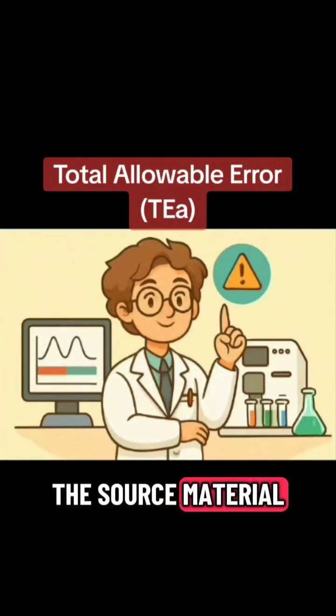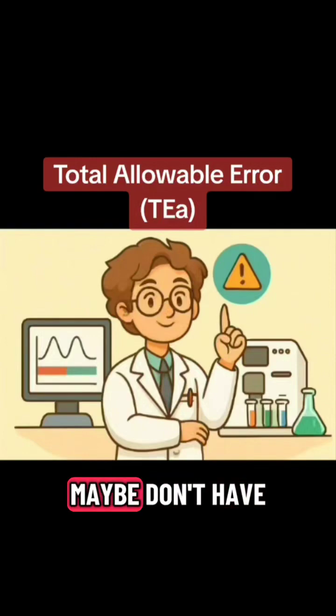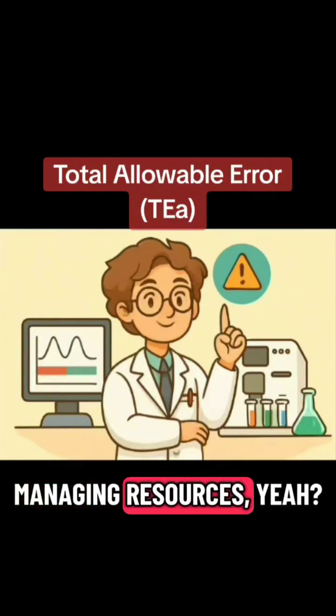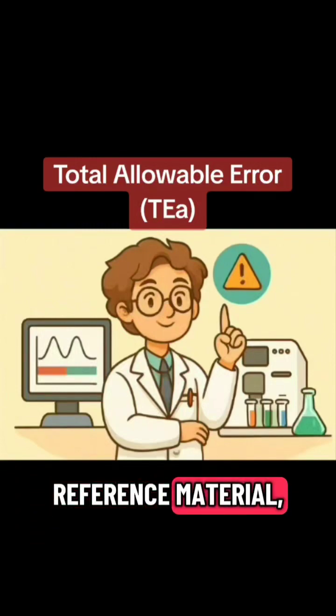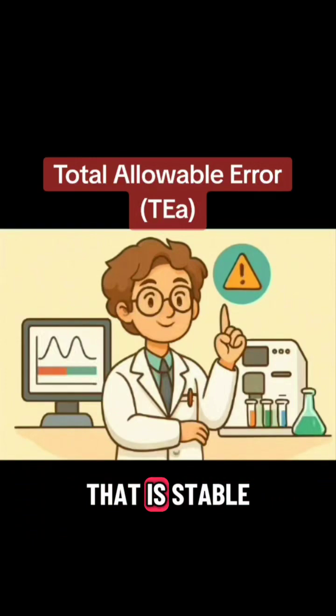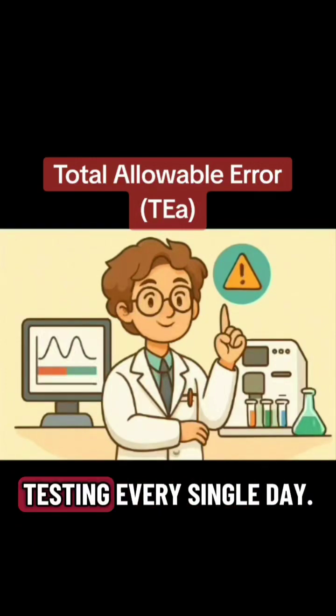I remember the source material had a really practical tip for labs that maybe don't have access to expensive reference materials. Yes, and this is key for managing resources. If you don't have that ideal reference material, you can use stable, well-characterized patient samples. The point is to use something that is stable and truly represents what you'll be testing every single day.